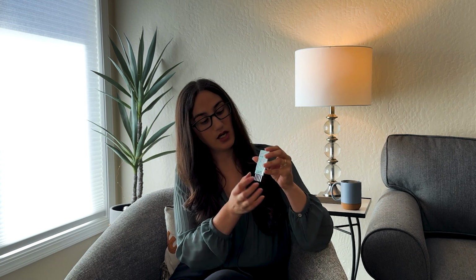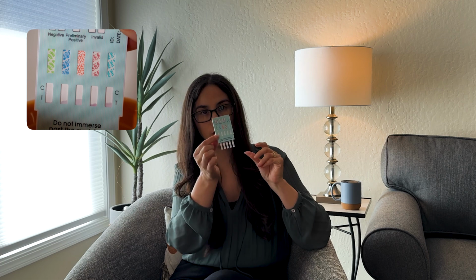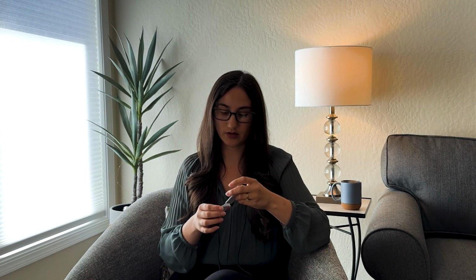With the cup test, the testing strips are inside of the cup. And with something like this, what you would do is remove the cap and dip the testing strips into the sample. You would want to hold it there for a couple of seconds. What you're looking for is to see the liquid creep up here into the testing boxes. Once it does that, you would go ahead and close this up and put it to the side until it's ready to be read.